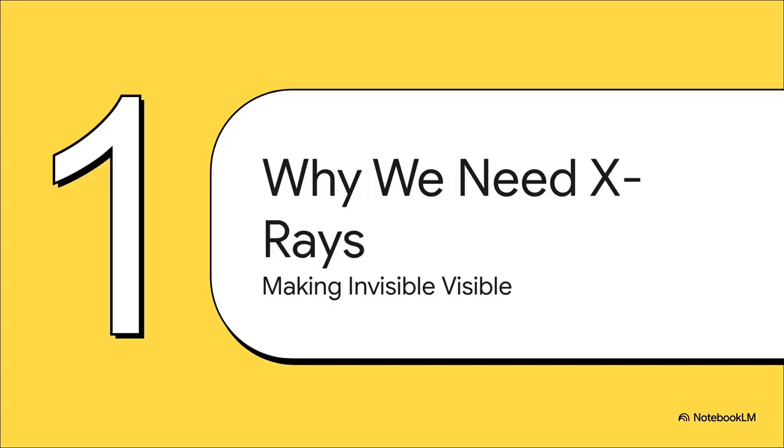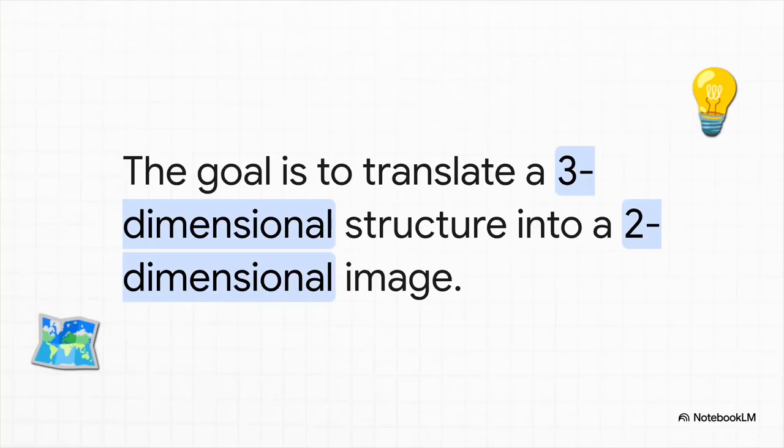All right, so how do we actually do it? How do we take all of this hidden, invisible information and make it visible? Let's dive in. You see, the whole challenge, and really the genius of the whole thing, is figuring out how to translate the complex 3D reality of your mouth into a simple, flat 2D image. But it's an image that's just packed with diagnostic clues.